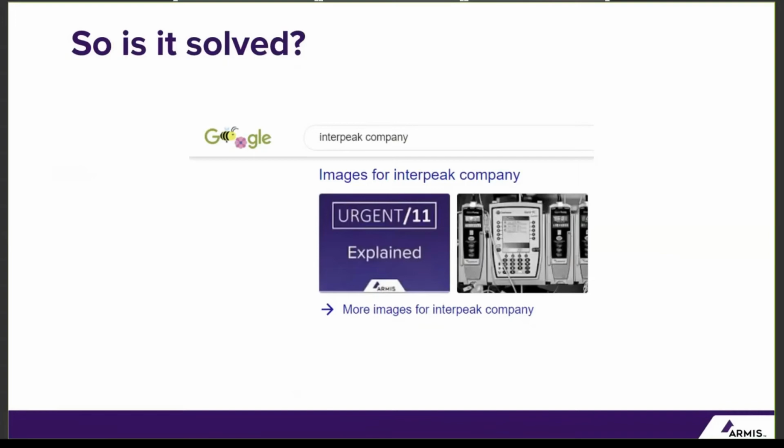So now I want to talk about the next part of the research, which was trying to understand how we can do it in a more practical manner. Because saying you can find a theoretical problem inside medical equipment is not good enough to go and alert your medical clients, right? You need to show it. And I think there is a really big problem inside the medical industry when they think they're safe because people can't buy medical equipment that easily. It's not just like buying a router and then playing around with it at home. It's expensive and it's not sold as commonly.